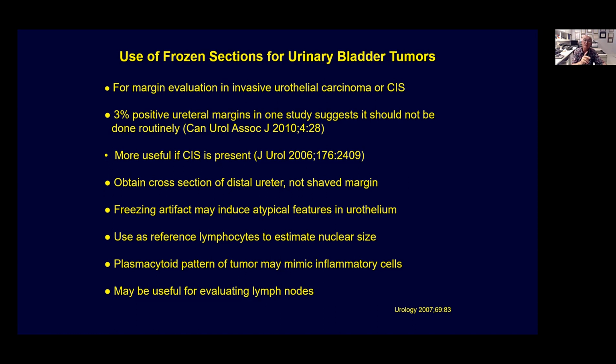And also the difference in the morphology of the nuclei. When you find the nuclei are not identical all along, that each nucleus is completely different from the next one, that is also another important feature.